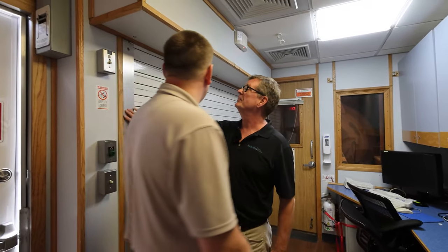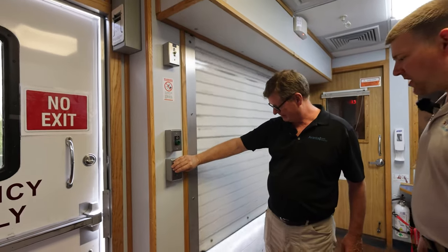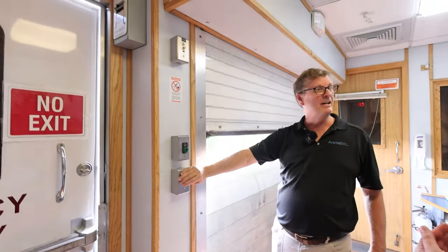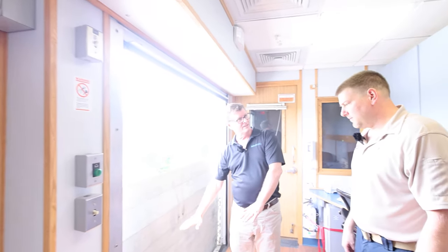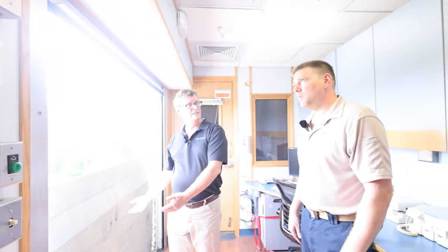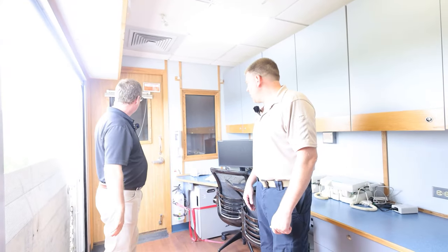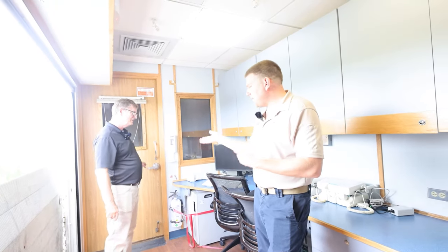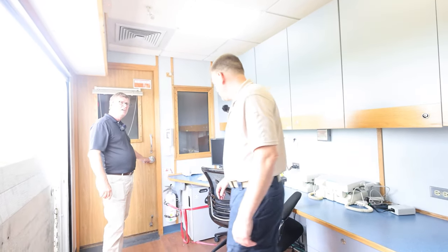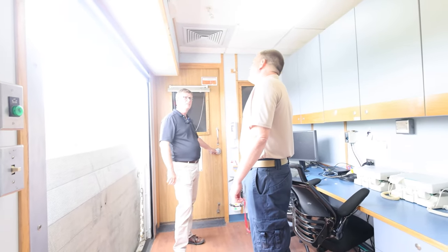Right here is the roll-up door. Okay, so is that where the patient comes in? This is exactly right. This would fold down, the whole thing lets down. Roll the table in, or the bed, I'm sorry. Bring it up, take them right in. Oh wow, does the patient come in on the MR table? Is that how this happens? If they have to. You know, if they're mobile, they can walk in or be brought in a wheelchair. It depends on their state.